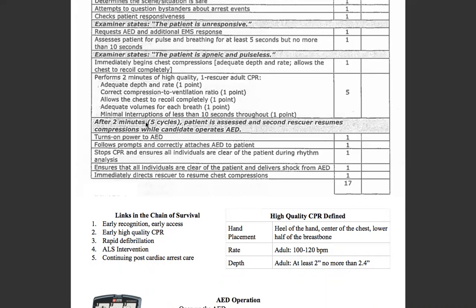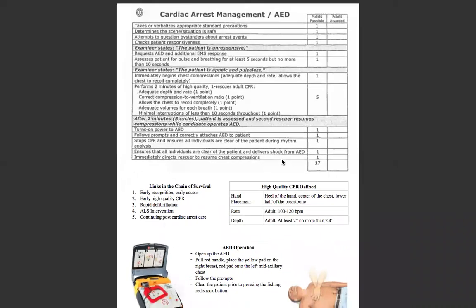After two minutes, the patient is assessed and a second rescuer resumes compressions while the candidate operates the AED. Turn it on, follow the prompts, correctly attach it, stop CPR, everybody clear during analysis. Ensure that individuals are clear of the patient and deliver a shock from the AED. Immediately direct the rescuer to resume chest compressions. That's the end of the skill.